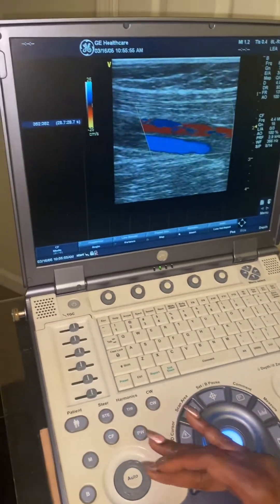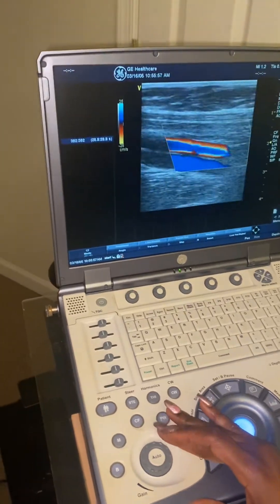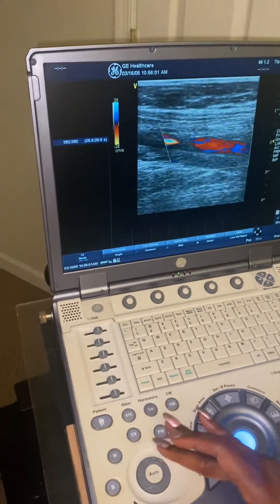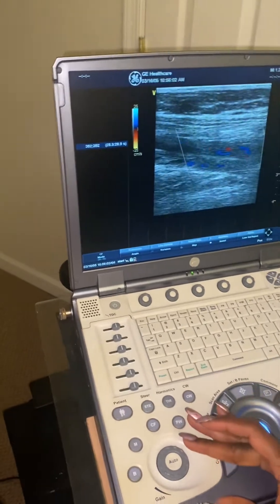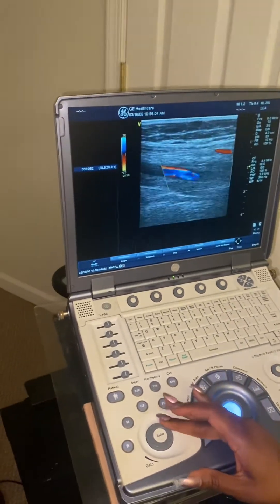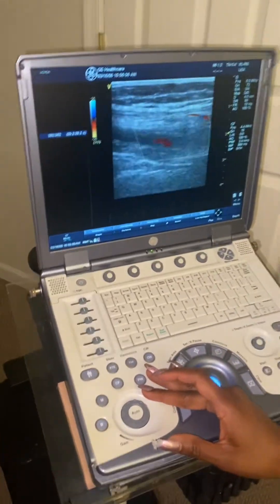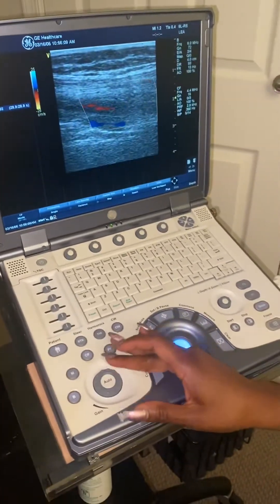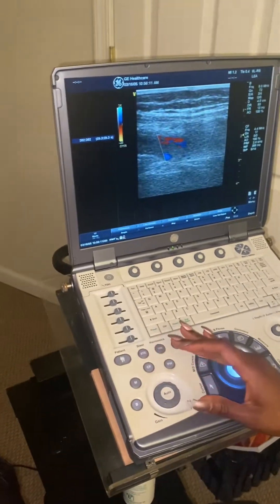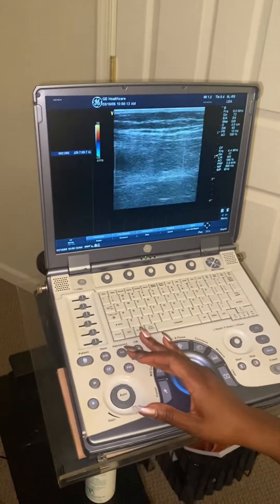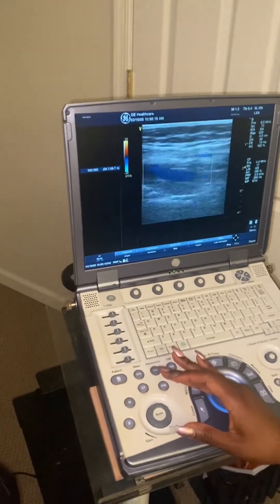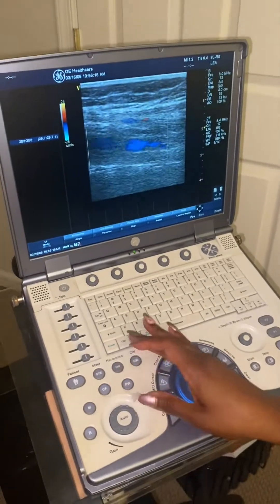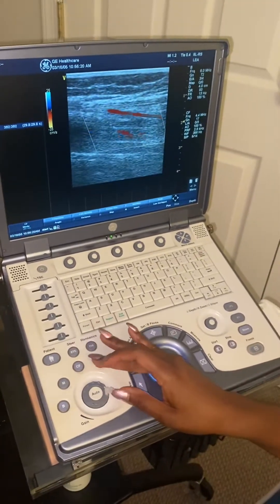I'm going to turn my color gain up because at the distal segment the vessel is a little deeper, so you want to turn up your color gain so that you can optimize the flow within that vessel. Right about this segment it can be difficult. Another thing I try to do is steer my box different ways to see if I can optimize the flow within that vessel — I also tried steering the box straight down.